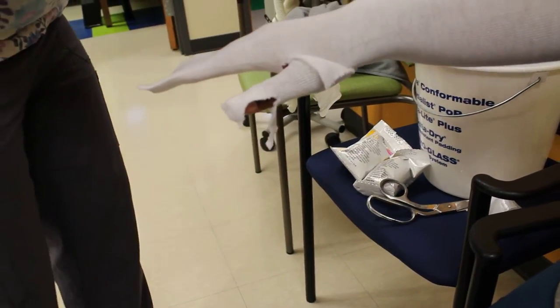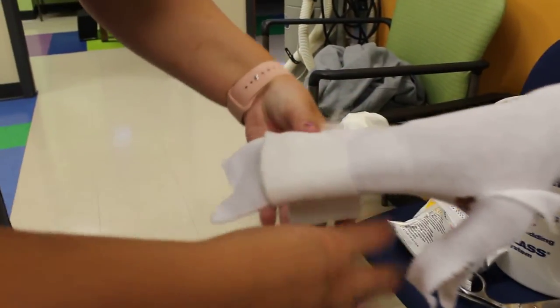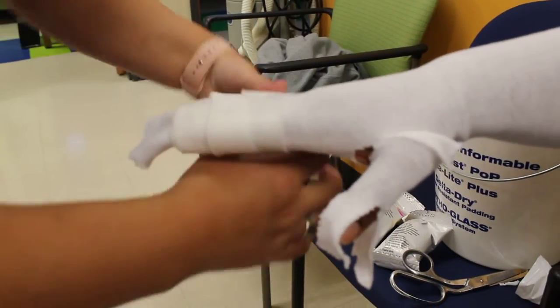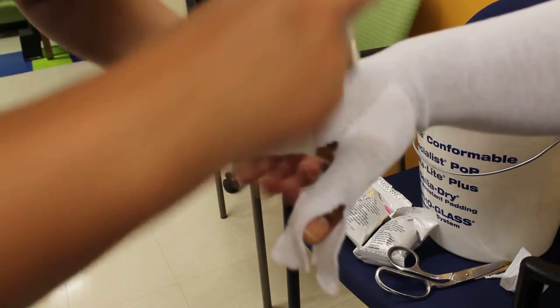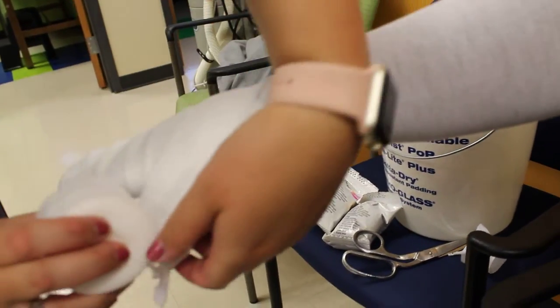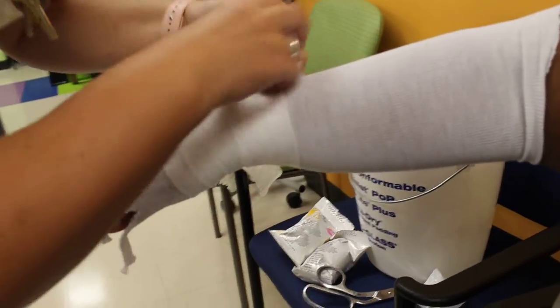We're going to wrap it with the cotton, and we need to start at the fingertips. We're going to overlap by half all the way down. Then you can come back through and kind of loop the thumb in there, just making sure that you cover everything.